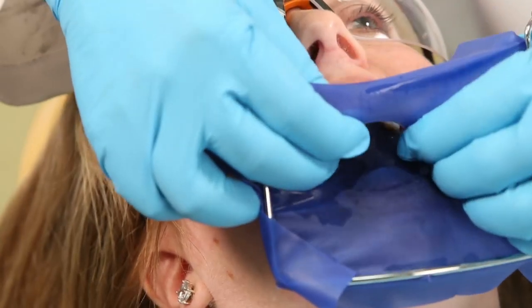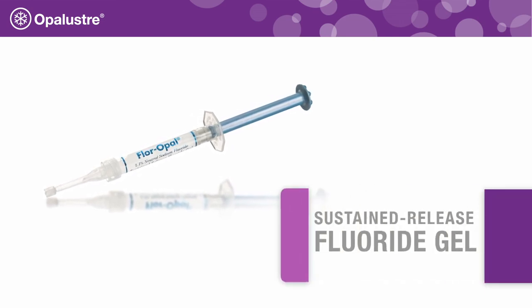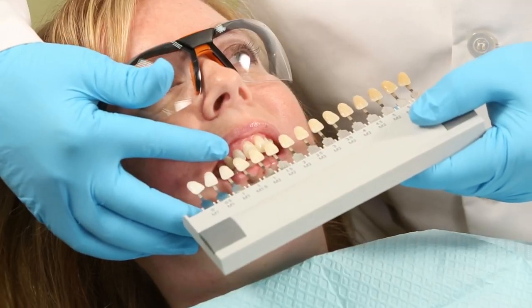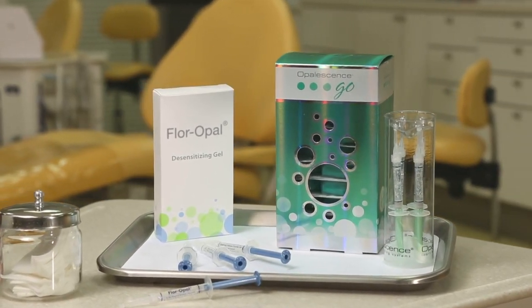After the final rinse, remove the rubber dam and sealer from the teeth, then rinse thoroughly. Apply a neutral sodium fluoride gel to the enamel for 4 minutes. Remove fluoride gel, evaluate teeth, and record the final shade. Take-home whitening products can be used pre- or post-op to blend and further whiten treated teeth.